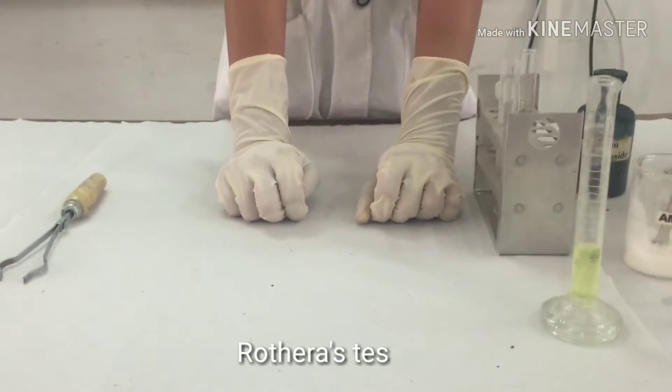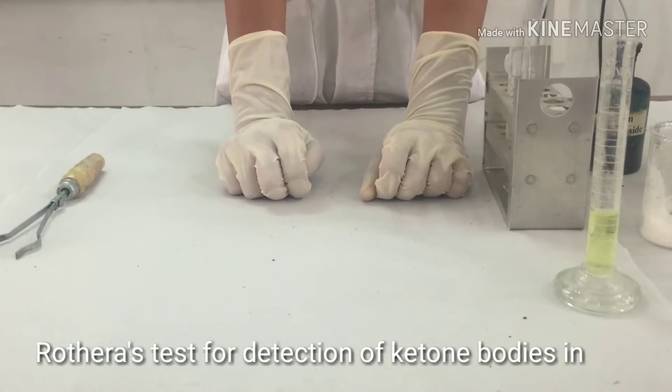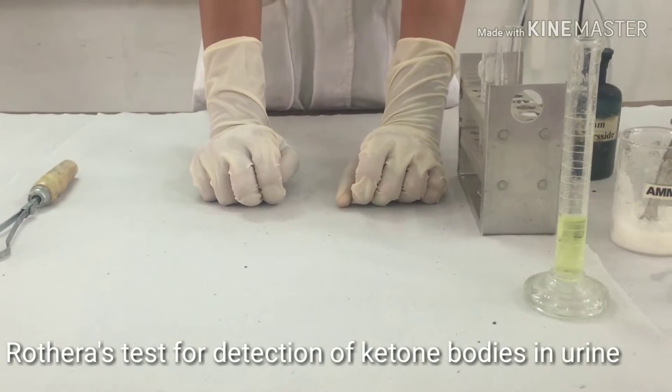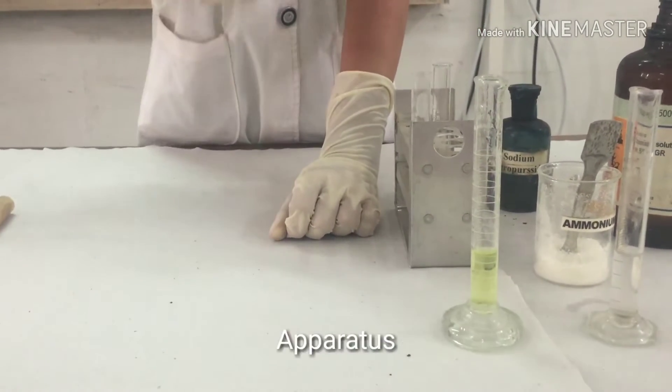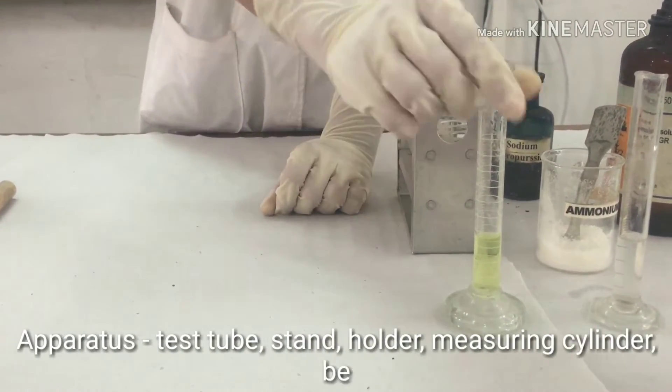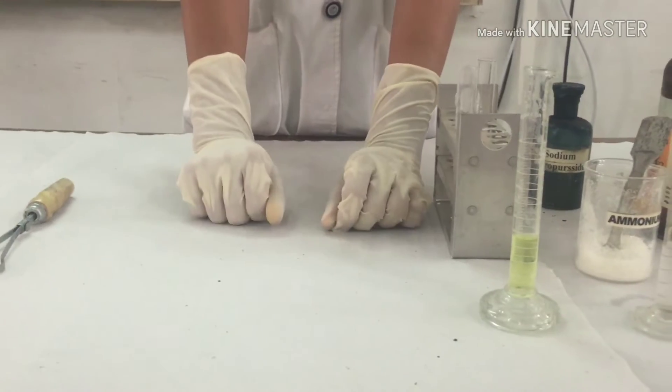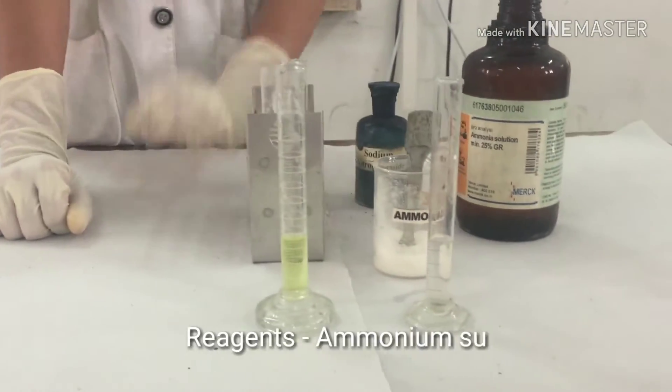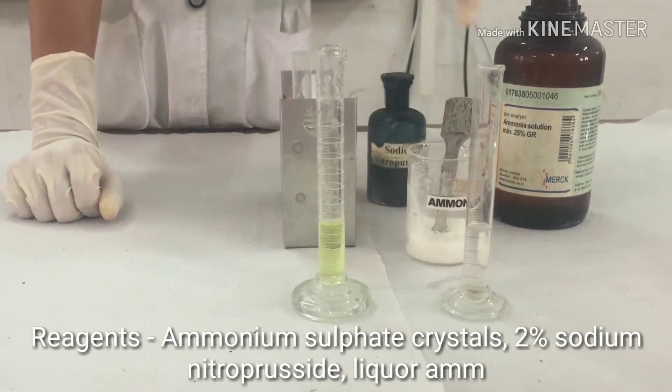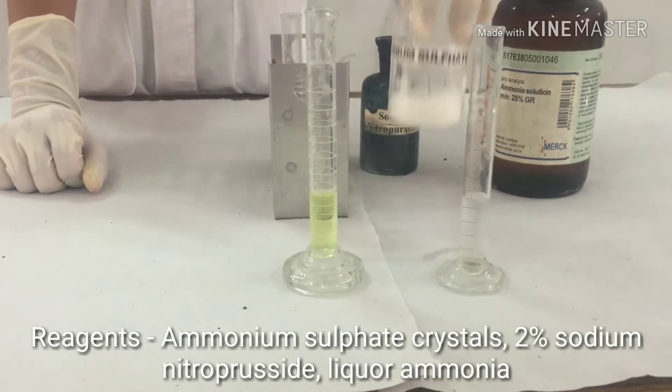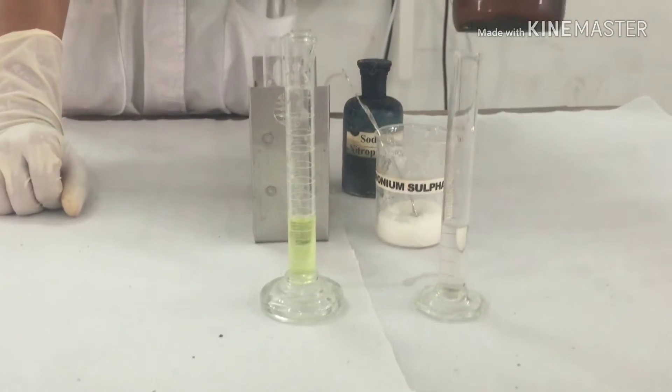We are going to perform Rothera's test for detection of ketone bodies in urine. The apparatus used for this test are test tube, test tube stand, measuring cylinder, and a test tube holder. The reagents used for this test are sodium nitroprusside, ammonium sulphate, and ammonia solution.